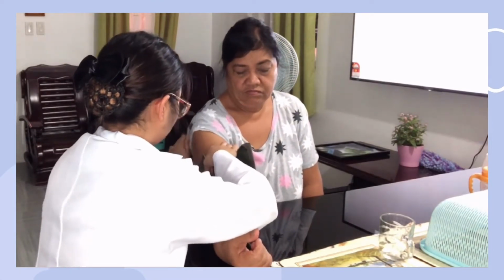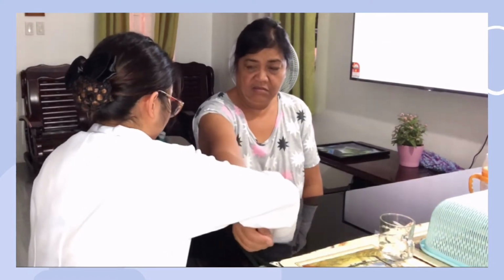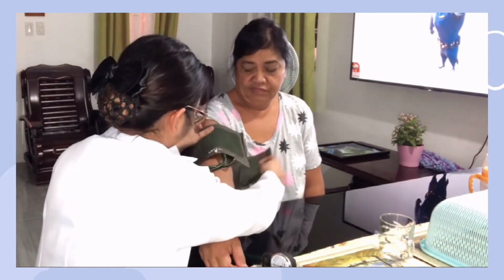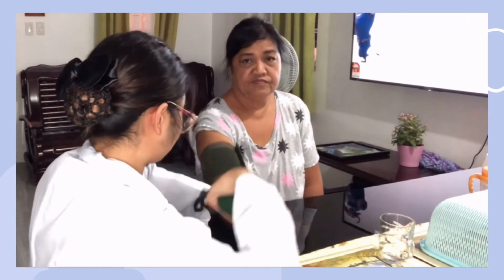And then, wrap the deflated cuff evenly around the upper arm. Locate the brachial artery and apply the center of the bladder directly over the artery. For an adult, place the lower border of the cuff approximately 1 inch above the antecubital space.